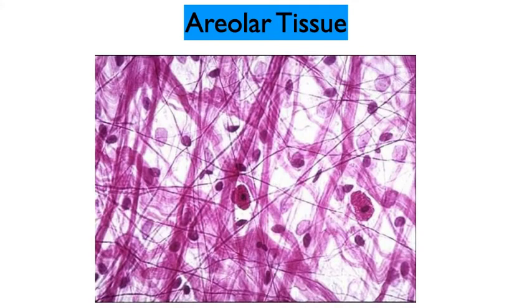Moving on, then, we have what is called loose connective tissue or areolar connective tissue. You can see this does not look nearly as dense. You see lots of fibers. Those are collagen and elastic and reticular fibers crisscrossing throughout the background matrix, which we refer to as a ground substance.